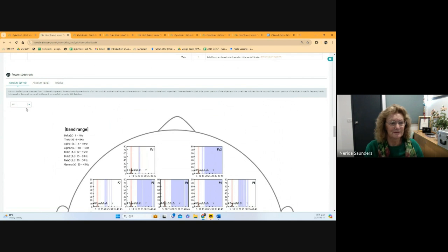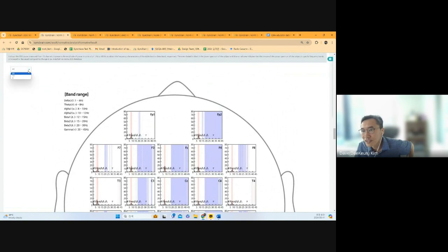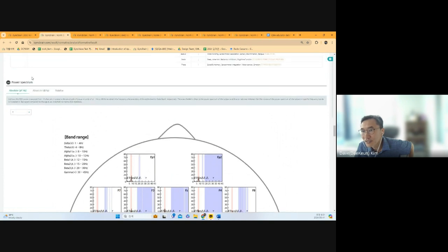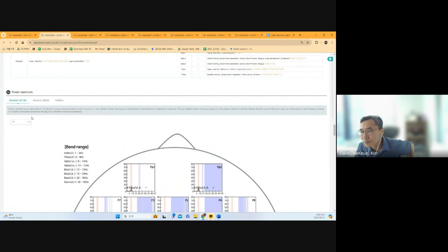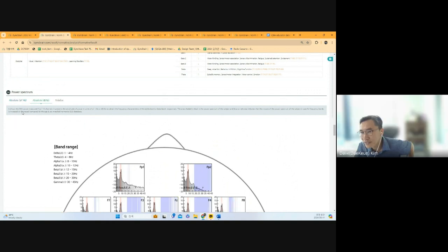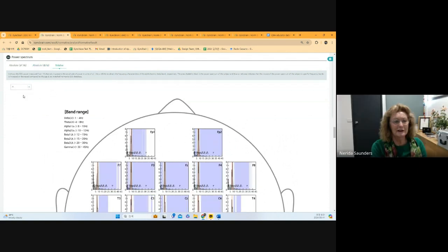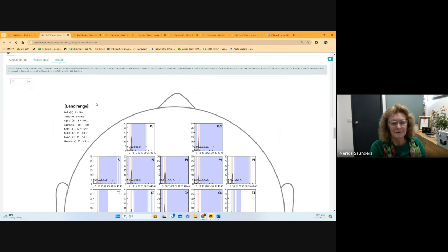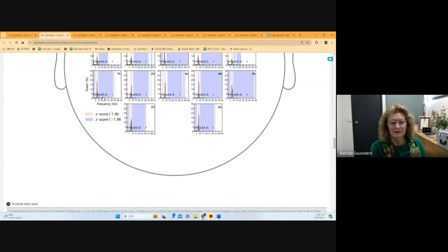Beautiful. Okay. From 80 to 40. Oh, this is not changing here at the moment. I need to check why this is not working. Okay. But usually in relative power, you can see the difference. Very good.